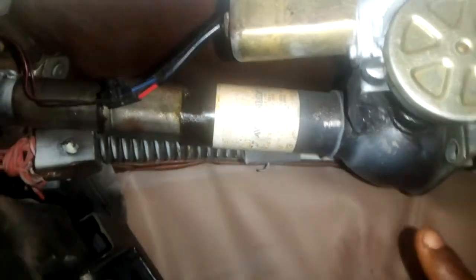So there is a similar motor down here, just below the seat. It also has a jack, and also has a window motor here. So the whole configuration makes an actuator. So I wired these. The wires that connect to the motors that move them go inside up to the power supply. These motors are supplied by the power supply.